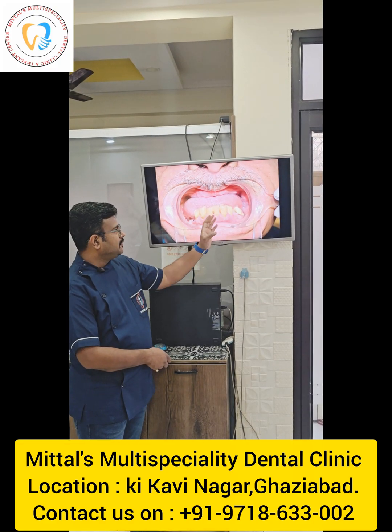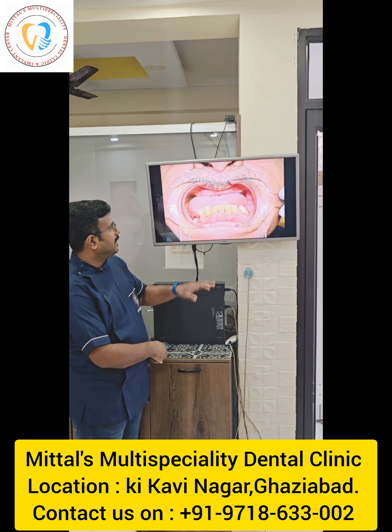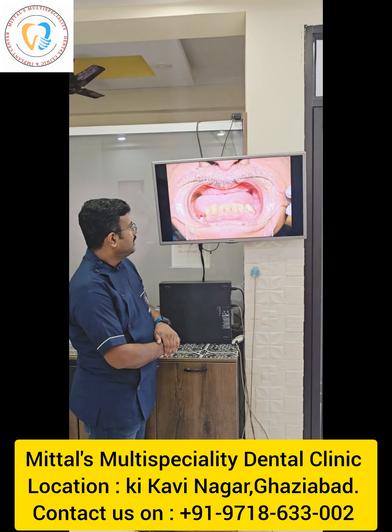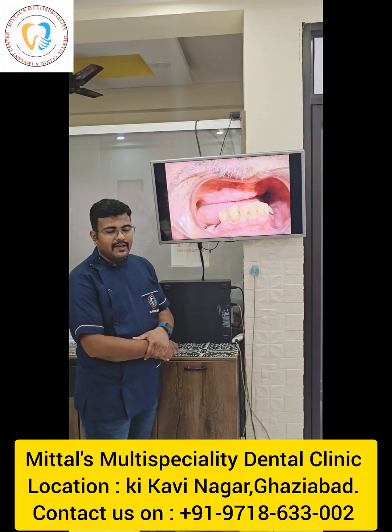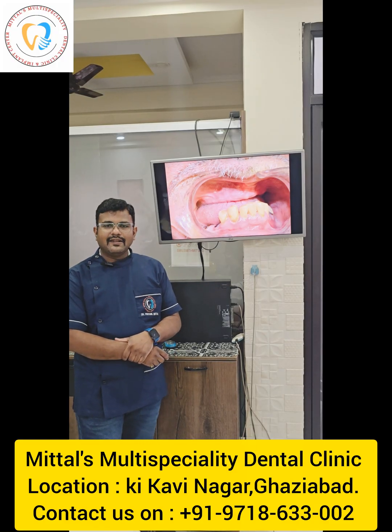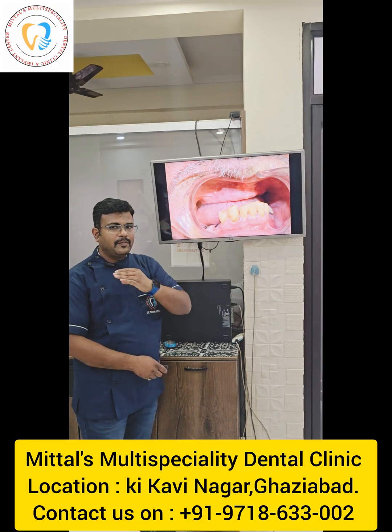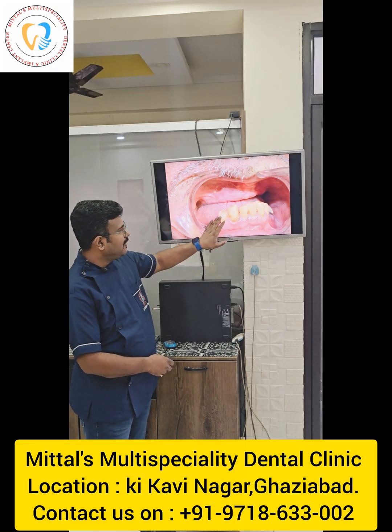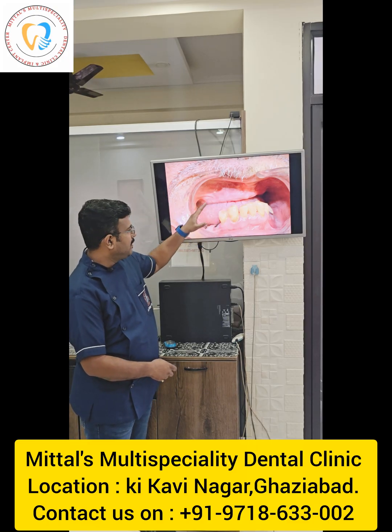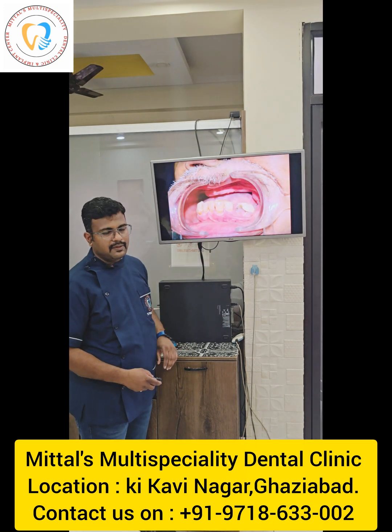The lower anterior seems good enough with periodontium, with bone support, but the upper arch has already been extracted and resorbed ridge. So as I always say, again in the diagnosis part only we have to evaluate the inter-arch distance and the relation of the maxilla and mandible. So in this right side pic you can see that the maxilla is not in line with the mandible. It is quite resorbed at the back side, and definitely the ridges are also not matching. Same is on the left side.